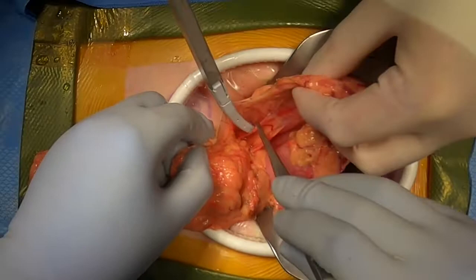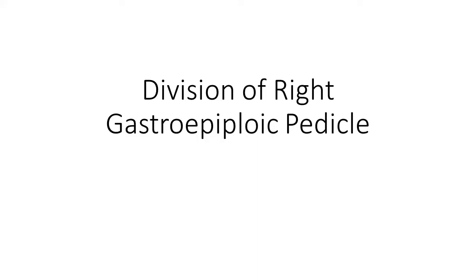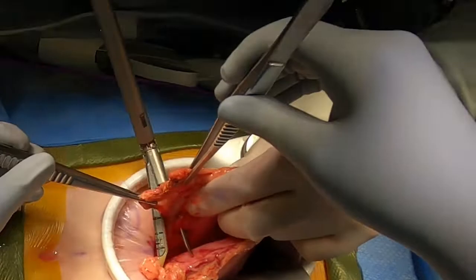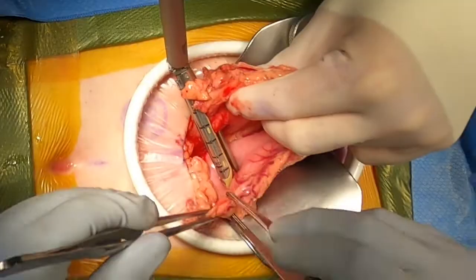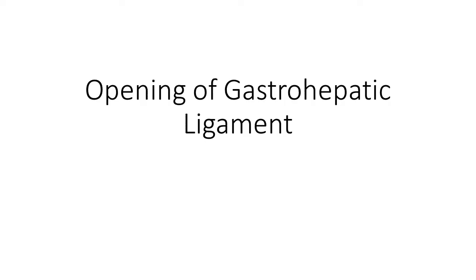Using a combination of electric cautery and a vessel sealing device, we dissected to enter into the lesser sac. Once adequate mobilization is achieved, the right gastroepiploic is identified and then divided using a stapler with a vascular load.